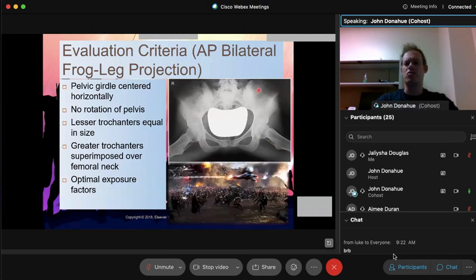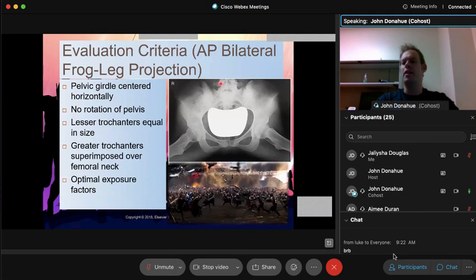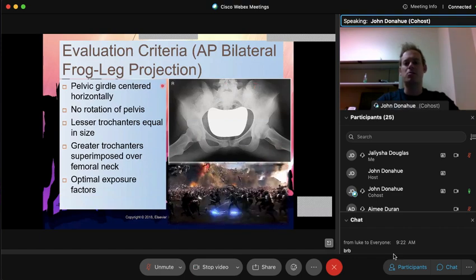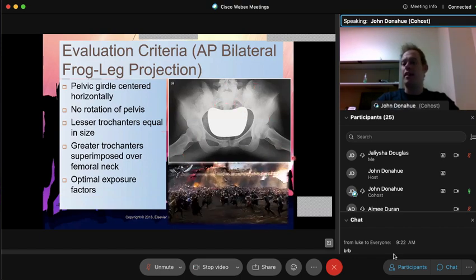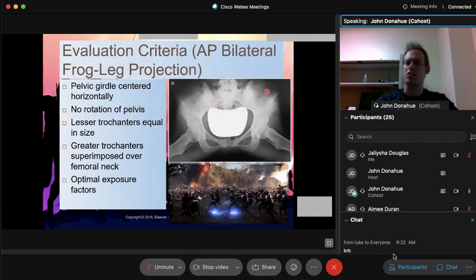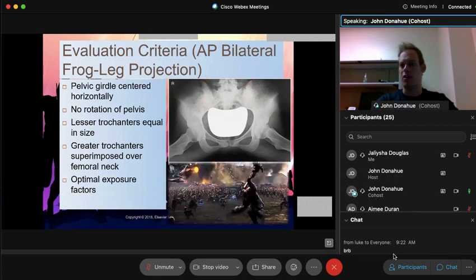And you will notice on this x-ray, guys, because you're going a little bit lower, it is acceptable on the bilateral frog leg to clip a little bit of the iliac crest. Not much, but if it's just barely clipped up here like you see, that's considered acceptable because the main thing they're evaluating on this bilateral frog leg is the femurs and the hip joints. AP pelvis will go ahead and cover all this area. That's not going to change in this position. So it is acceptable to cut a little bit of that iliac crest off on this bilateral frog leg for the pelvis.